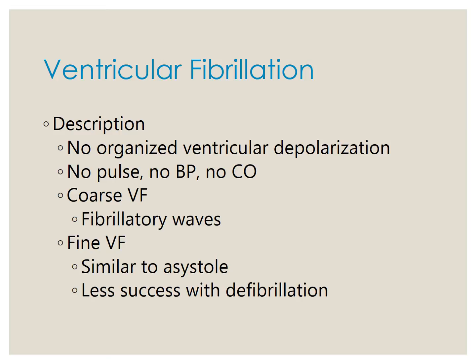Then we have ventricular fibrillation. There is no organized ventricular depolarization going on, okay? This is a medical emergency. So imagine shaking a bowl full of Jell-O, and how it shakes around like that. That's what the ventricles in the heart are doing, okay? There are no contractions going on. The blood's just getting shaken around in there, but there is no rhyme or reason for it. The client does not have a pulse, any cardiac output, or a blood pressure, okay? So this, again, is a medical emergency.